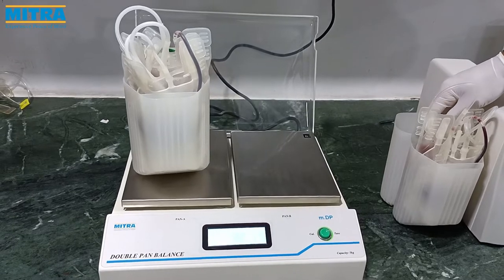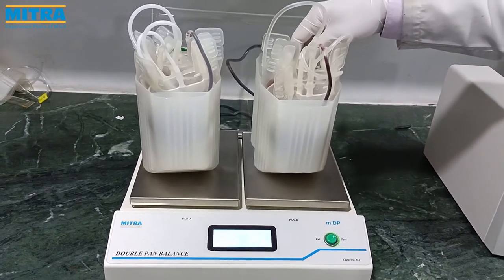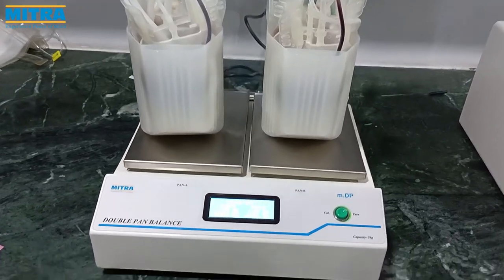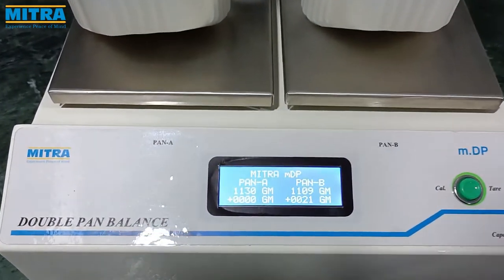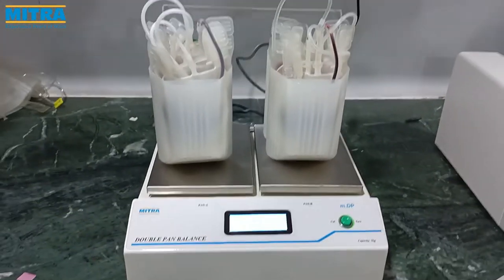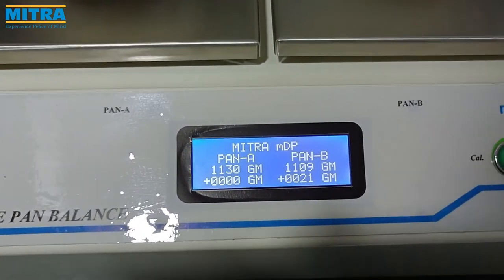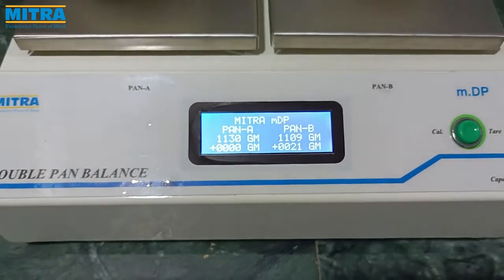Now balance the centrifuge buckets. This process is called the balancing process. Put both buckets on separate pans and check whether both are equal in weight. The respective weight of each pan is displayed on the LED screen display.